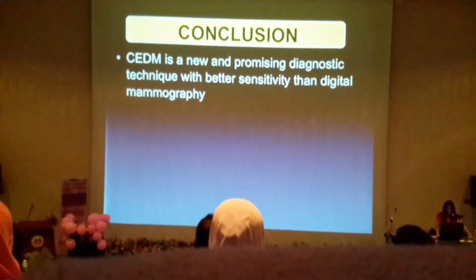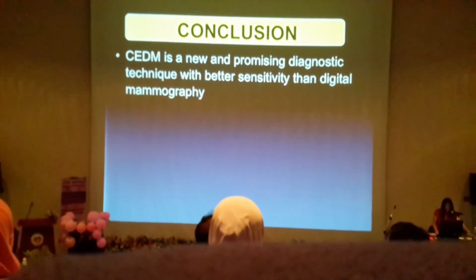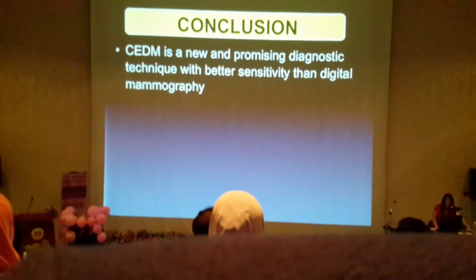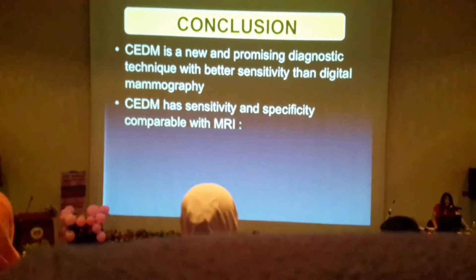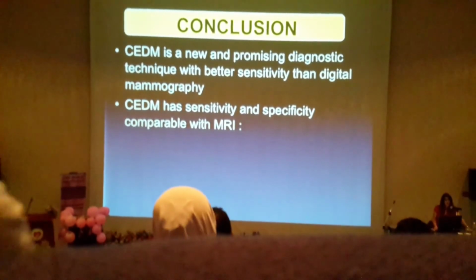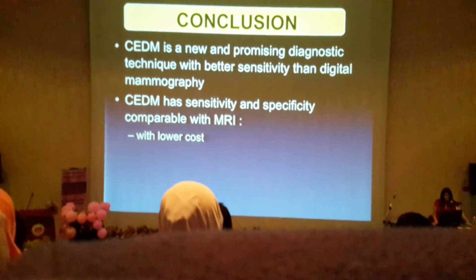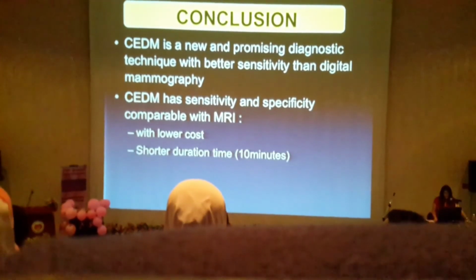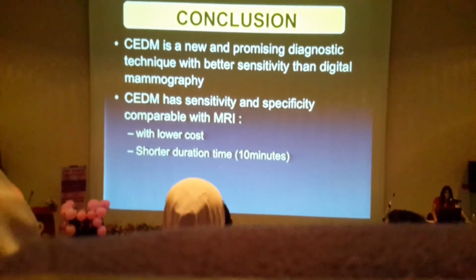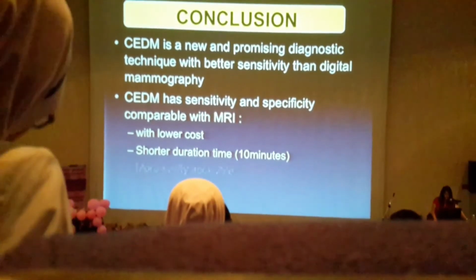So, in conclusion, contrast-enhanced digital mammography is a new and promising diagnostic technique with better sensitivity than digital mammography. It has sensitivity and specificity that is comparable to MRI in all the studies that have been done. It comes with a lower cost as compared to MRI. It is a shorter duration of time, 10 minutes compared to 30 to 60 minutes for an MRI.